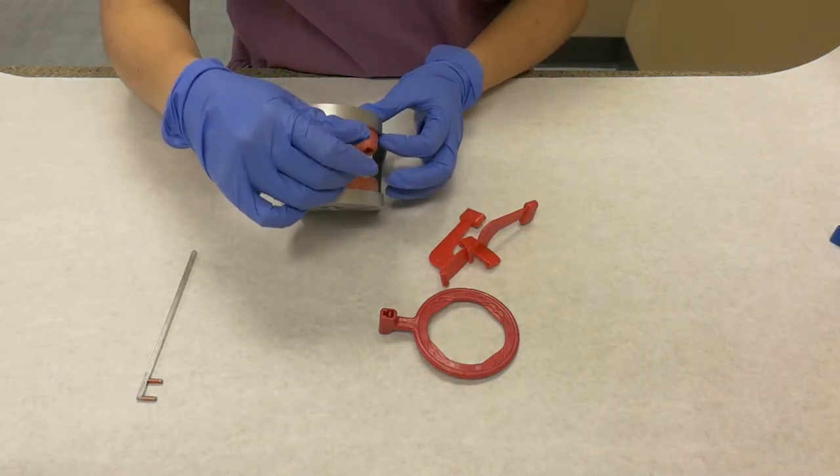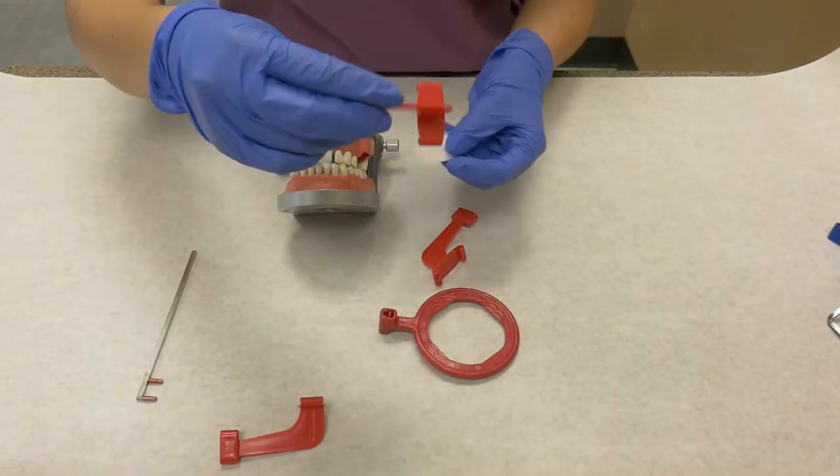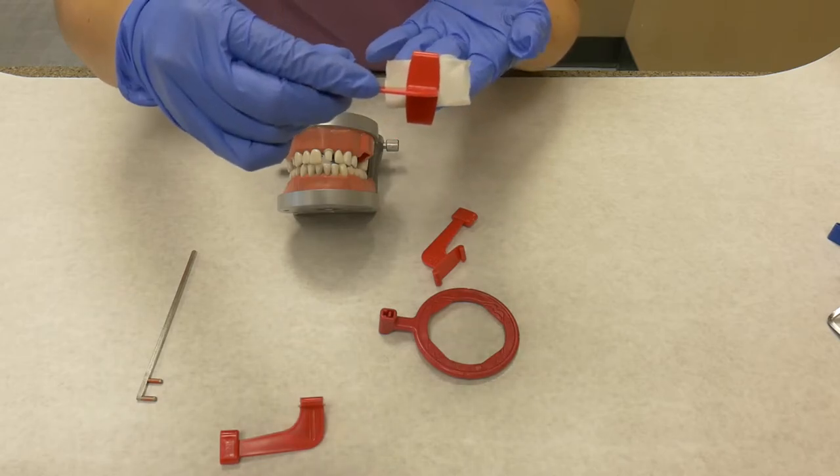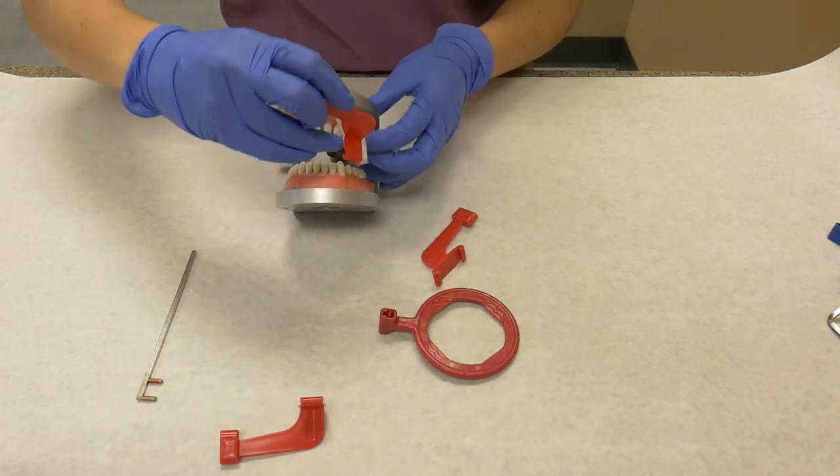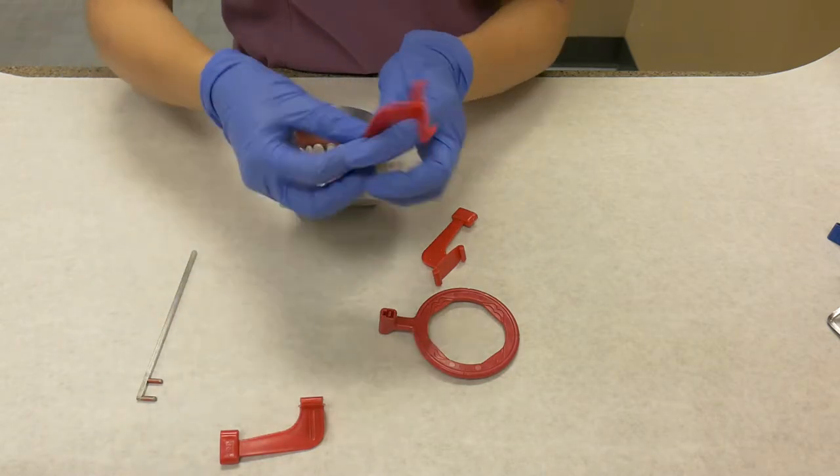This is how the bite plate will be placed in the patient's mouth. The receptor will be placed horizontally, and the patient will bite on the long, flat portion of the bite plate.